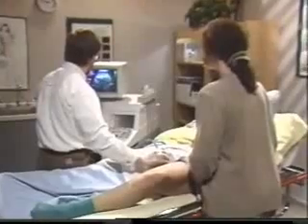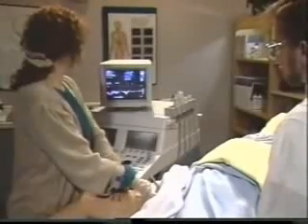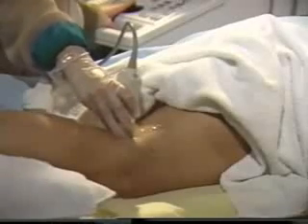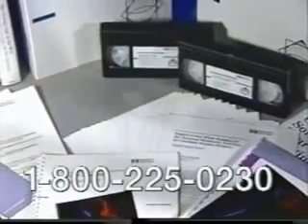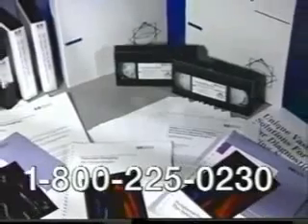This tape has presented normal anatomy of the lower extremity venous system. It has described a protocol for transverse and longitudinal examination of the proximal to distal thigh vessels, and has demonstrated a protocol with techniques for imaging the calf vessels using both transverse and longitudinal planes.